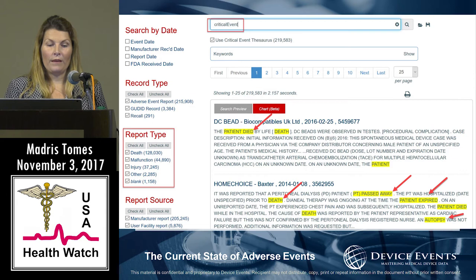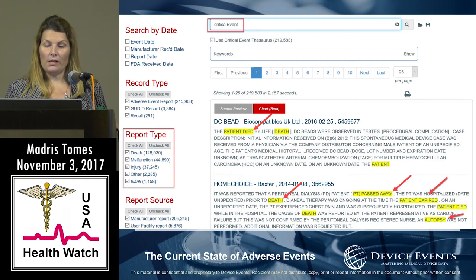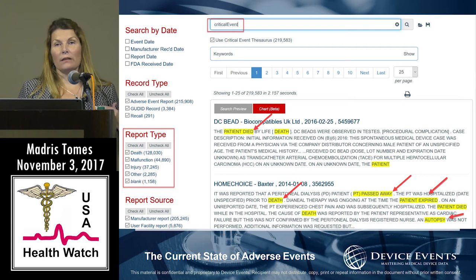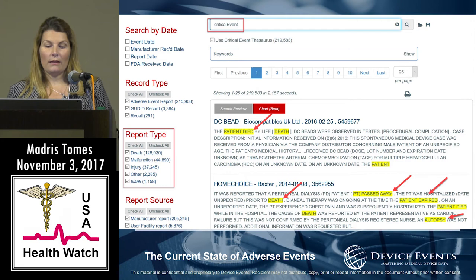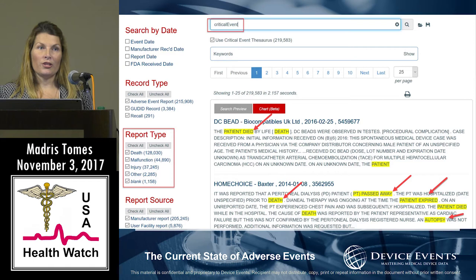The other thing you can look at in here is one of the problems that was explained to me fairly early on when I worked at the FDA. When the analysts receive the reports to read, the narrative, which is what you see in here, would reference a death or some kind of death-type event, yet the box that was checked over here would be malfunction or injury. The FDA typically, not always, reads the reports in order of importance. So they would look at the death reports first, then the injuries, and then the malfunctions. The problem with that is if you have manufacturers that are under-reporting and checking that malfunction box, those deaths can go unread for months to years.